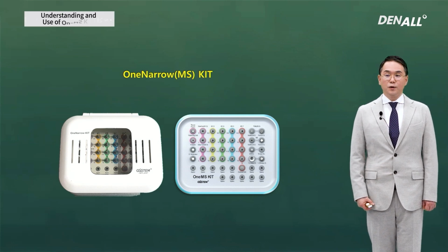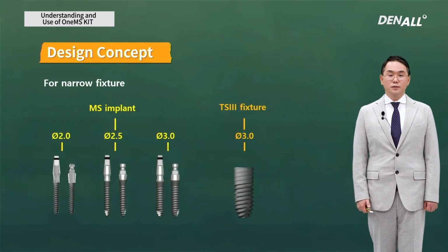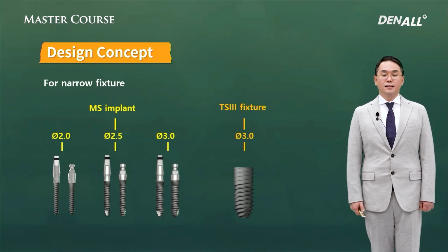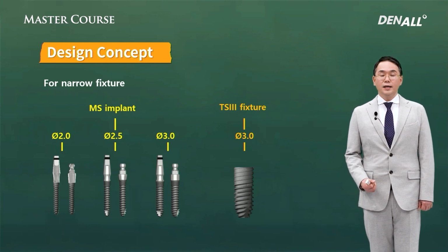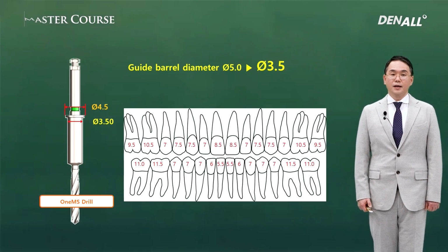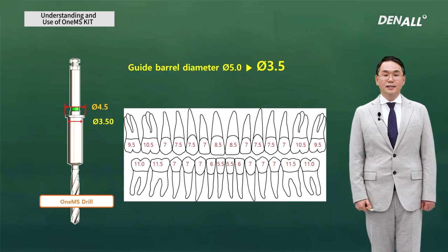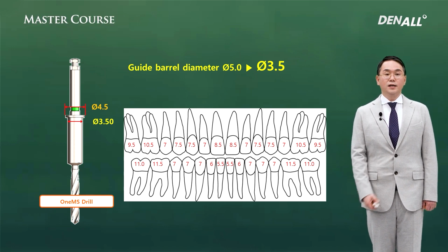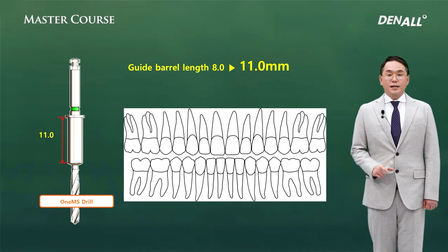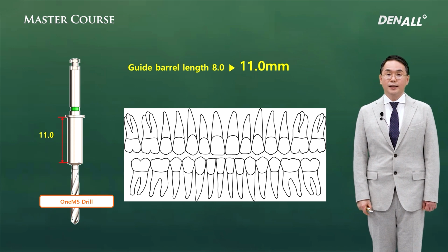If you want to use the OneMS kit, templates for OneMS implants need to be used. Let me talk about them. Implants like these can be placed with the OneMS system: diameters 2.0, 2.5, and 3.0 MS implants and the 3.0 TS3 implant. The diameter 3.0 two-piece type TS3 implant can be placed. The mesodistal distance is very narrow, so the existing 5.0 diameter OneGuide hole cannot be used. So the barrel part of the guide, the diameter, is reduced to 3.5. Also, the offset length of the OneGuide system is 10.5 millimeters, the distance from the top of the planned implant to the top of the guide hole.